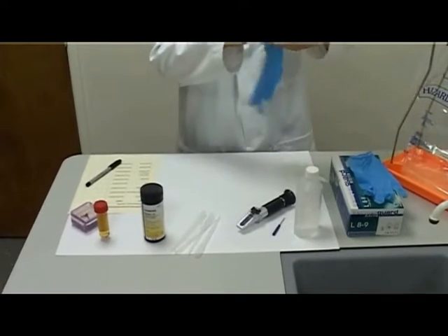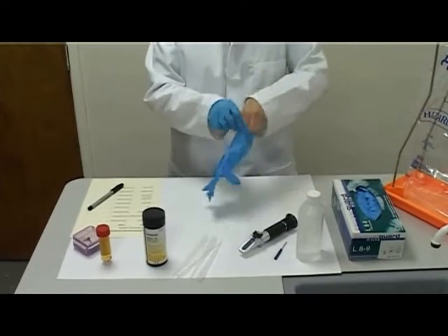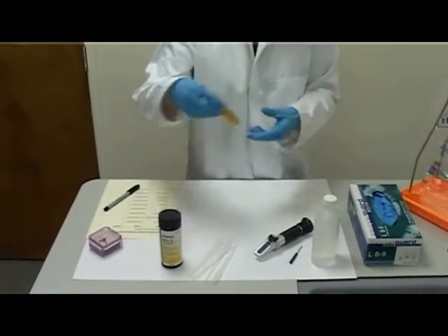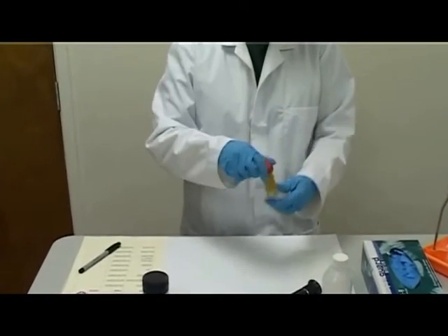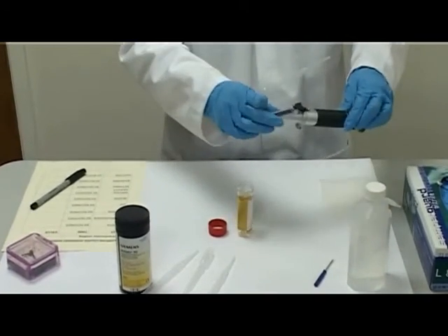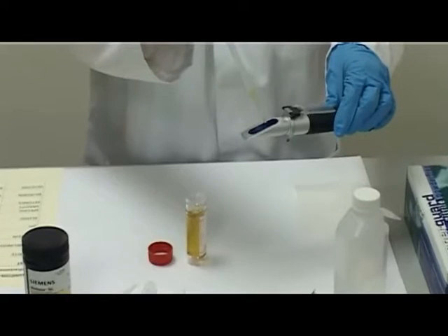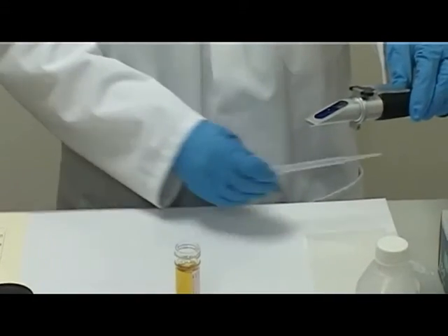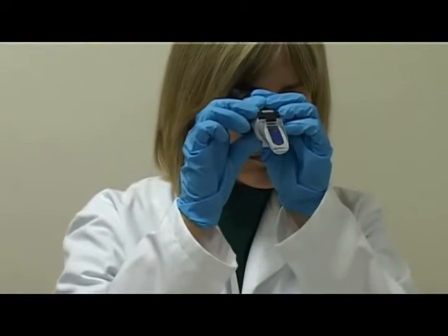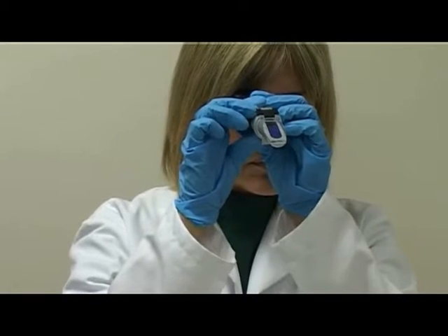Put on gloves. Invert the tube to gently mix the urine sample. Pipette 1–2 drops of urine onto the prism surface. Close the cover. Hold the refractometer up to the light source and look down the eyepiece. Read and record the actual urine specific gravity reading.